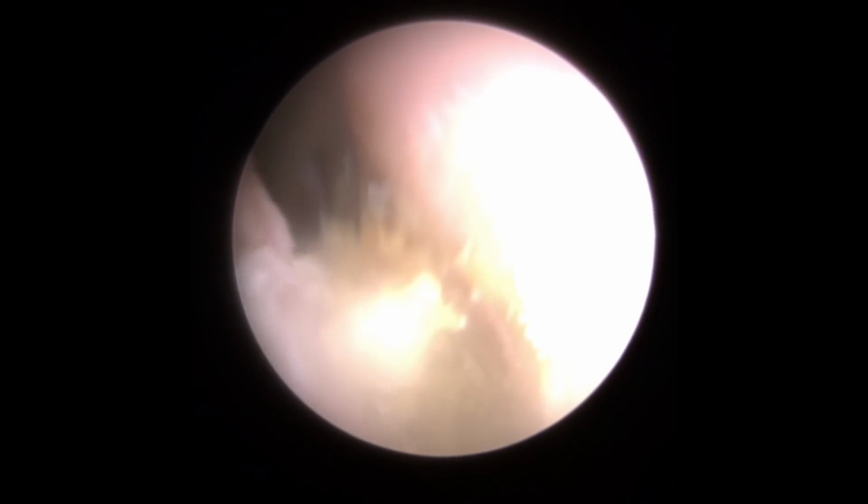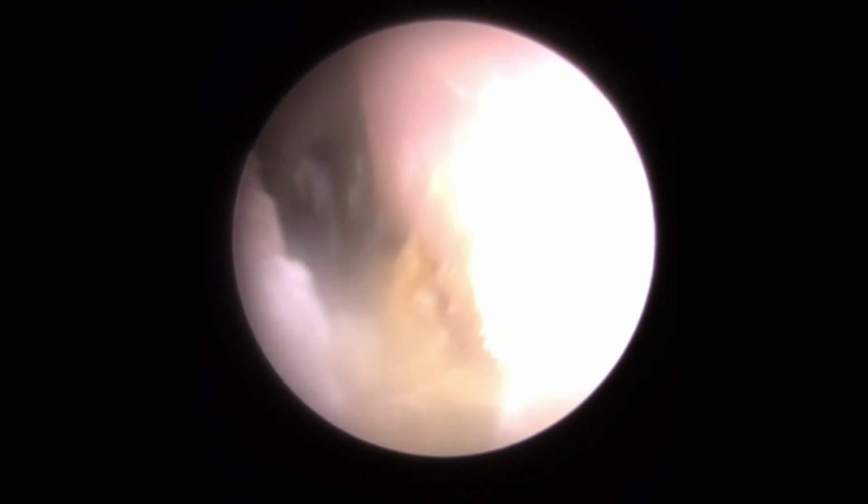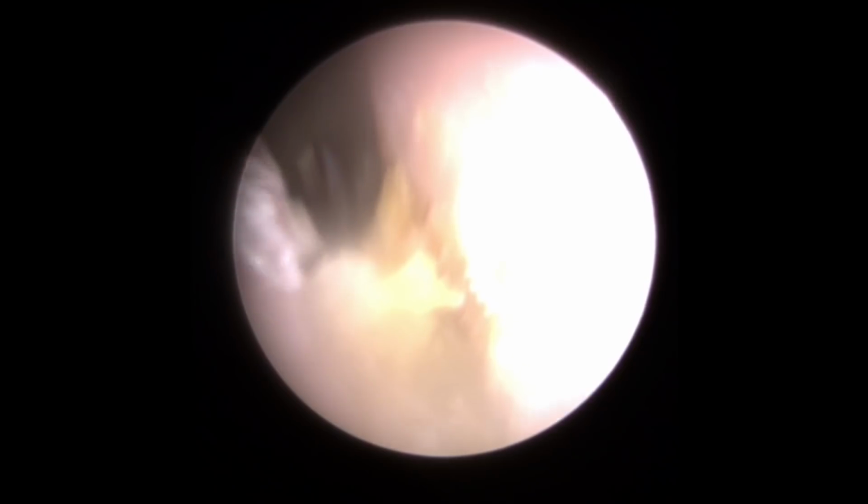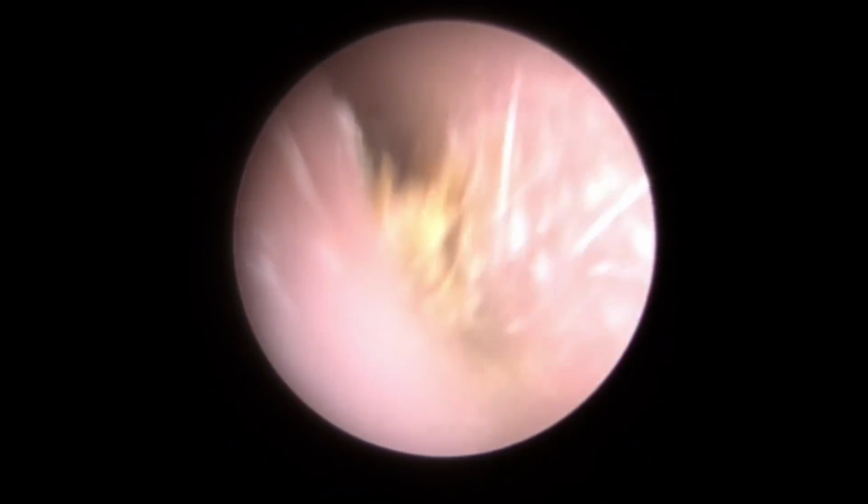Now the misting you can see on the camera, if the patient's very warm, then sometimes you can get a little bit of misting to the lens of the camera. Now normally when you're suctioning, you're taking away all that warmer air, so you don't really see it, but when you're using standard tools like these, you can get a little bit of misting as they're warmer than the camera popping in. You can see how we're only breaking little flaky pieces of this wax away at the moment. Stick with this though, because we do get this out.